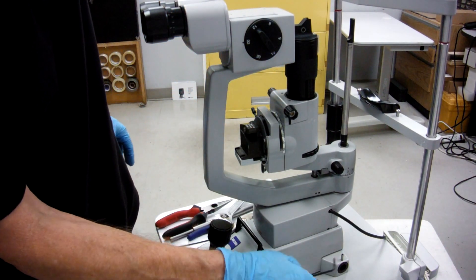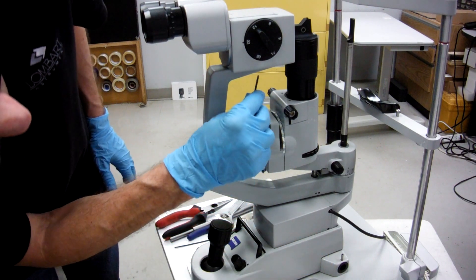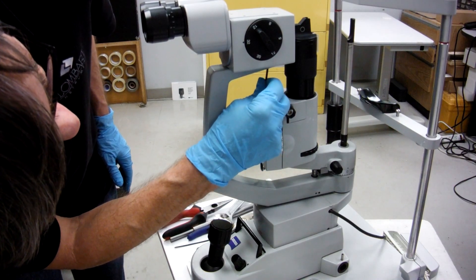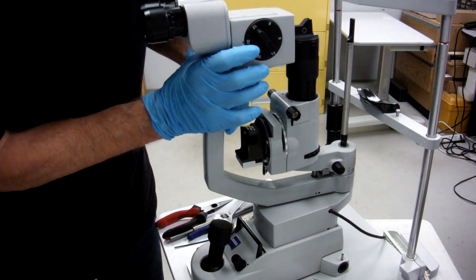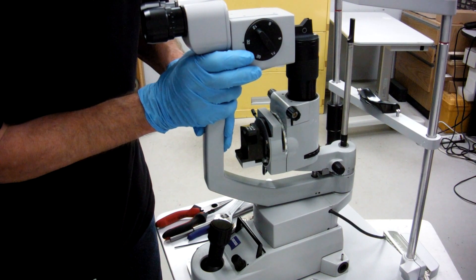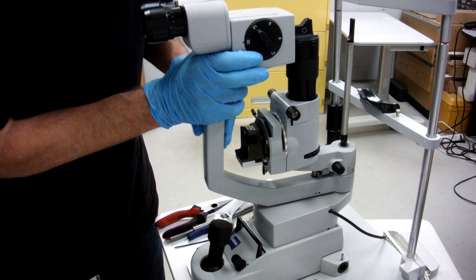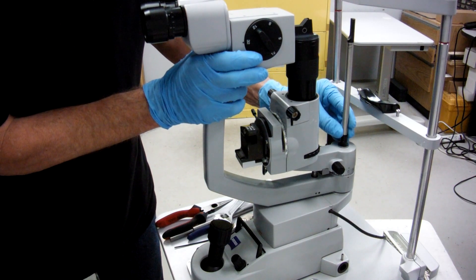And to be able to do that, there's two allens under here, one on each side. Just loosen them a little bit and then you can pull your head back and forth to get it nice and sharp to get your focus.